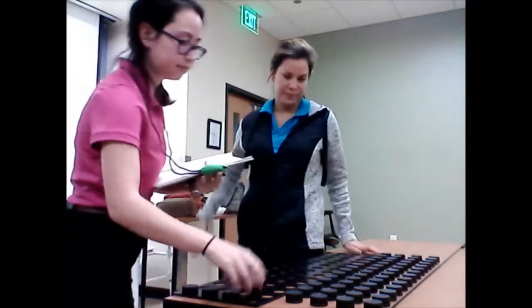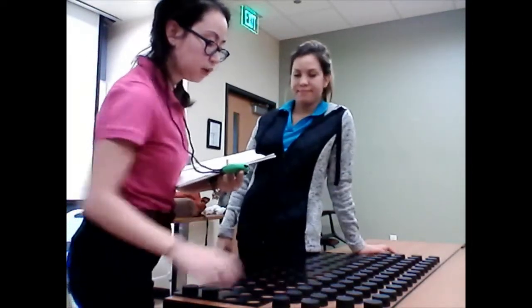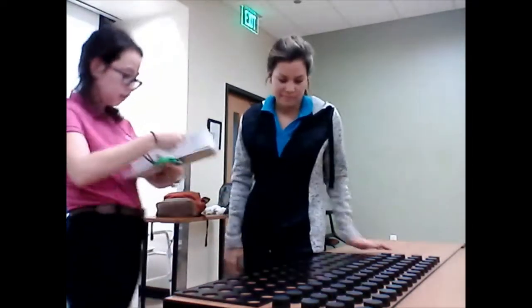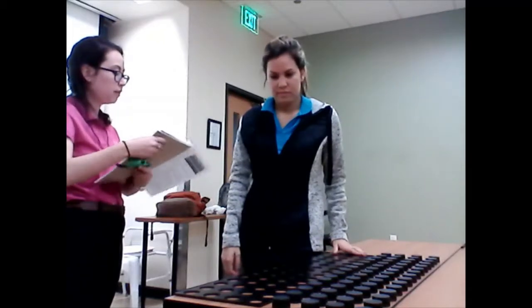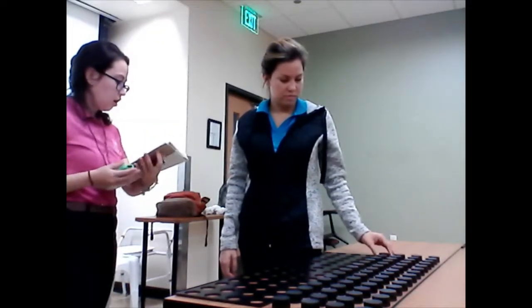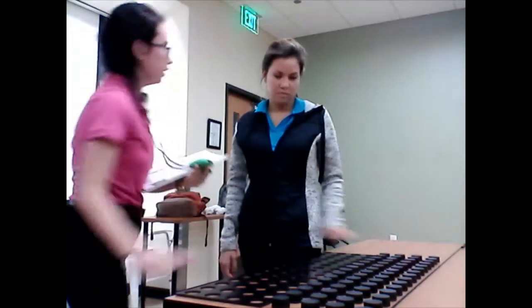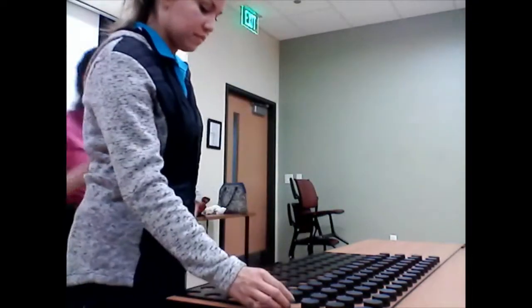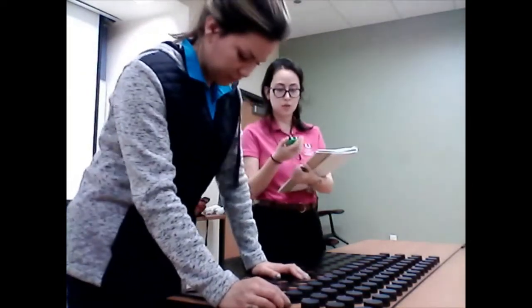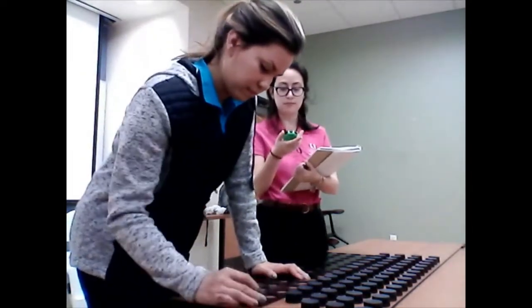Okay. You're going to want to do this as fast as you can. Your final score will be the number of seconds it takes you to do this several times. So please place your hand right here. And when I say go, you'll begin. 1, 2, 3, go.